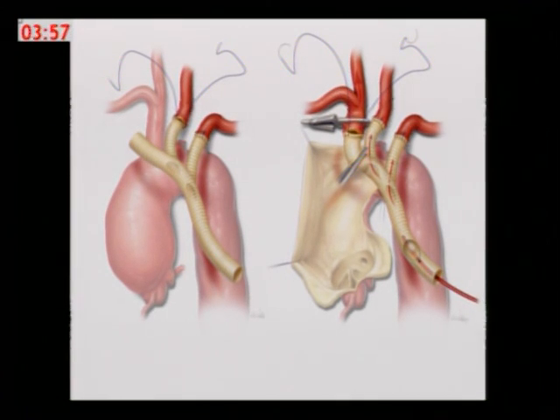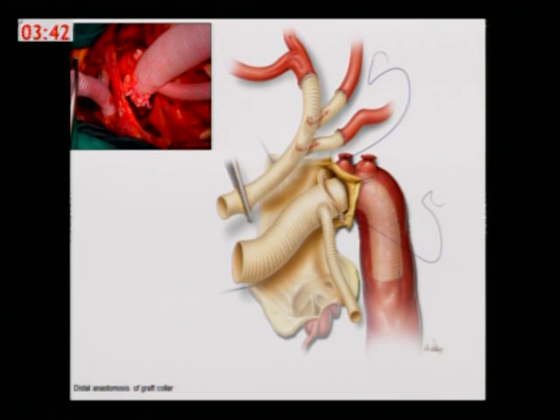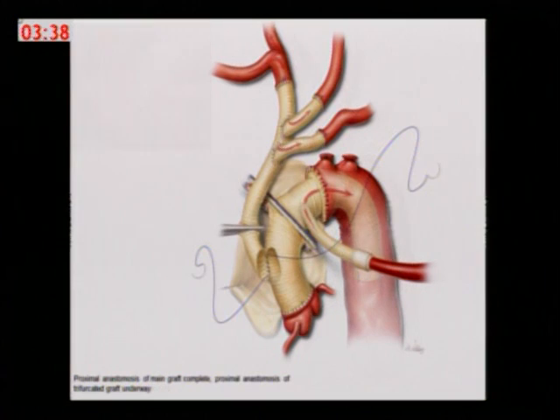We've moved from femoral cannulation to axillary artery cannulation, from retrograde cerebral perfusion to antegrade, profound hypothermia to moderate, island techniques to these Y grafts. So the actual open techniques have improved, and they've not been static. This multi-branch debranching of the head vessels, even with open total aortic arch repair, has really been a boon, in that we can now repair the transverse aortic arch with really zero cerebral ischemia. We've maintained blood flow to both vessels, the left common carotid and the innominate and right common carotid, virtually during the entire period of the repair.